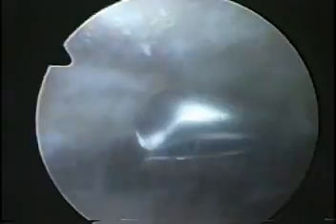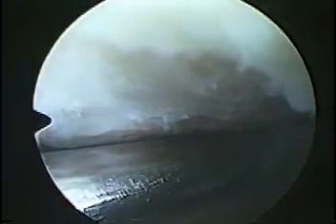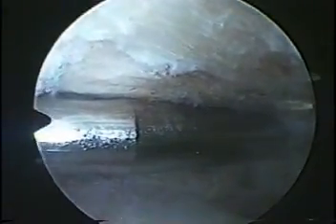Once the anterolateral corner has been satisfactorily debrided, the arthroscope is again introduced through the lateral portal and a blunt trocar is again introduced through the posterior portal, and the shape of the acromion again assessed and a type 1 morphology should be present. If the acromion is thin and curved, the cutting block technique must be modified such that fracturing or gouging of the acromion is avoided.